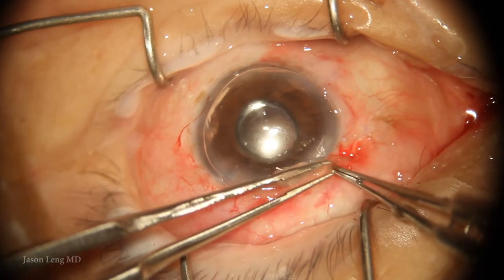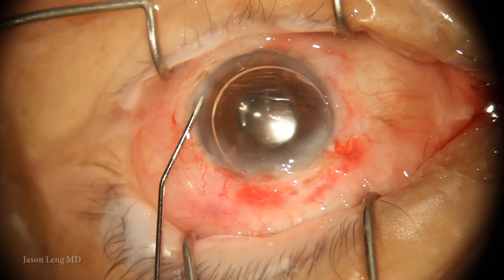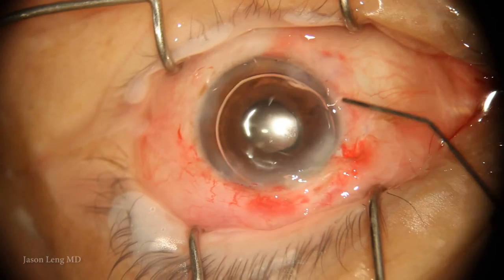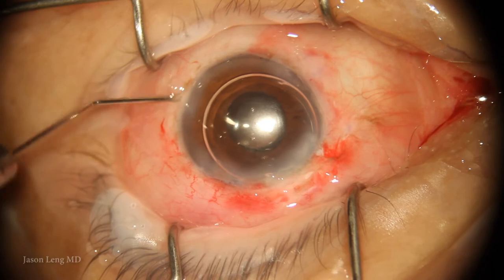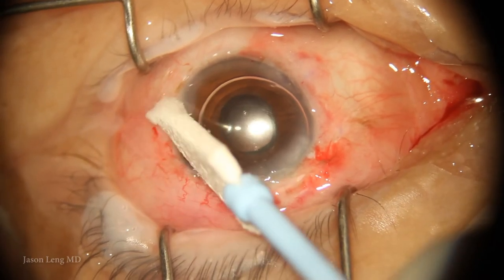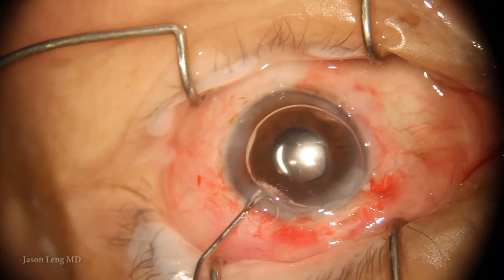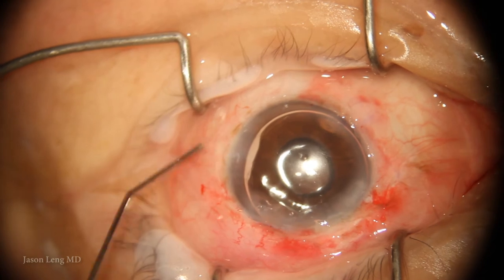I generally wait about a minute for the glue to cure, then readjust intraocular pressure with BSS. Here I'm also hydrating my paracentesis. I'm leaving an air bubble in the anterior chamber to prevent chamber collapse if there is hypotony — though sometimes I fill it just with BSS and it ends up fine. I've never had a flat chamber.